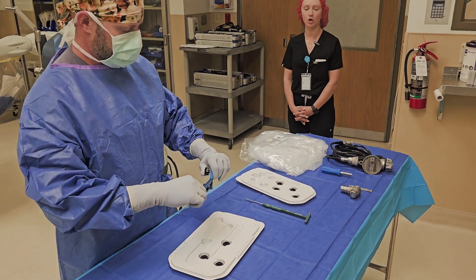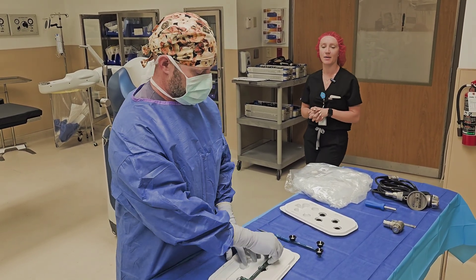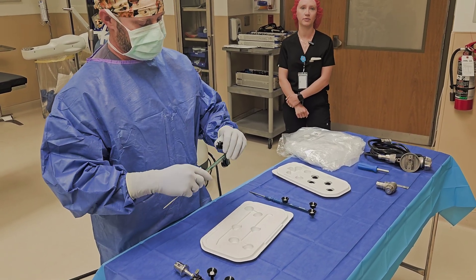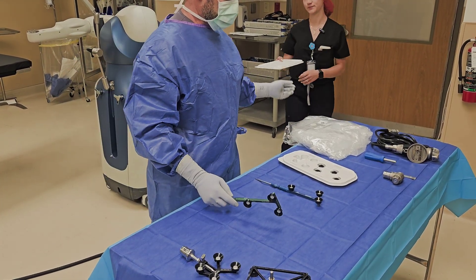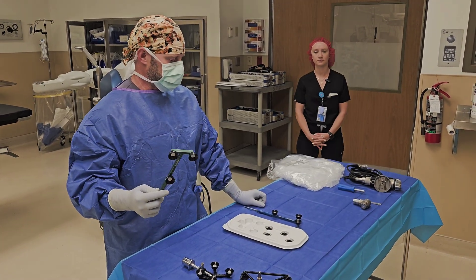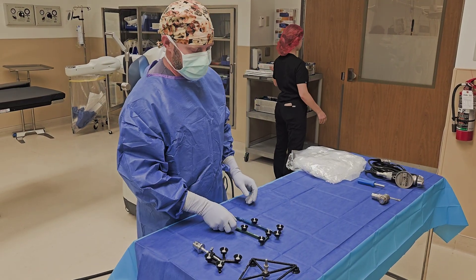The blue probe is a sharp probe — it pierces through cartilage, so be careful with it. The circular holder is for the green probe, which is our blunt probe; it maps on top of cartilage and is not sharp. The difference between the probes is that the green probe handles the gross measurements, mapping and calibrating the robot to the patient, while the blue probe takes finer measurements — using the CT scans to calibrate directly to the bone rather than just the larger anatomy.